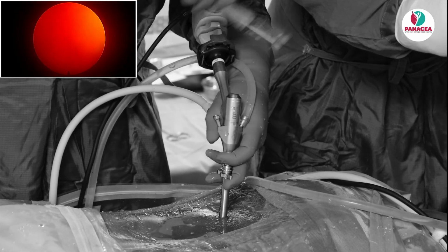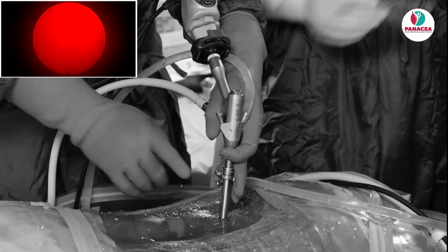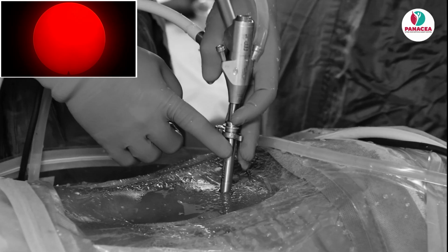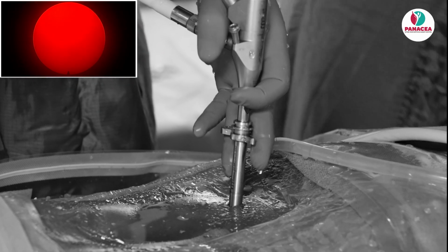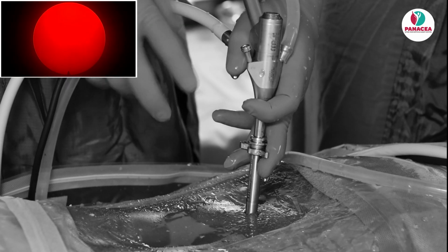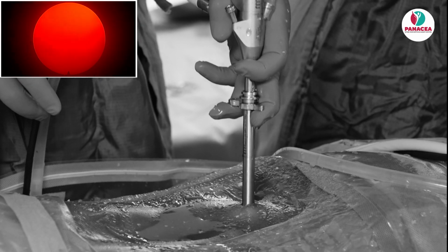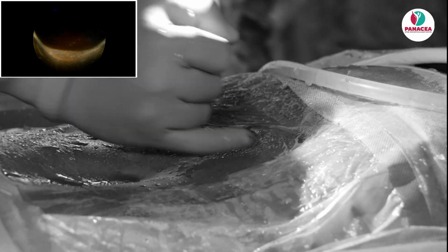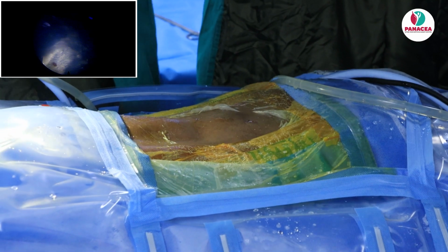Take it. So ultimately in endoscopic surgery, how you manipulate the working sleeve is the key. This is like a retractor, and you can see my hand movements as well as how I hold the scope. With 2 fingers I am trying to maneuver the working sleeve and the scope together. Okay. That's the end of surgery. Less than my finger. Hardly, this is less than 6 mm, and I will even show the patient's face.